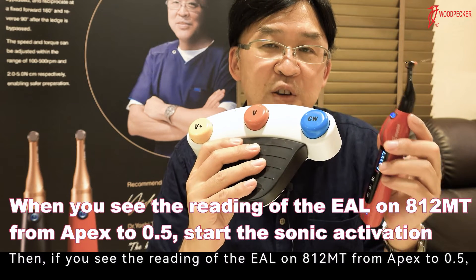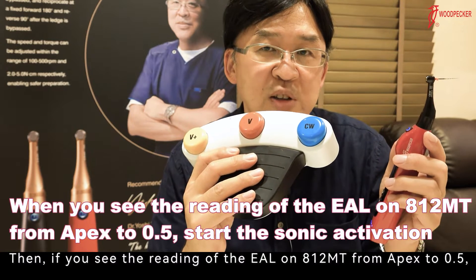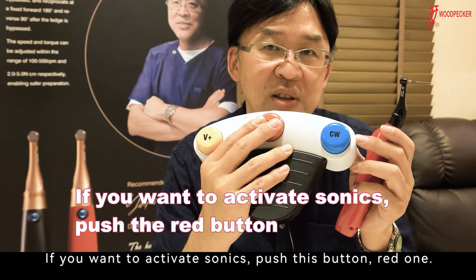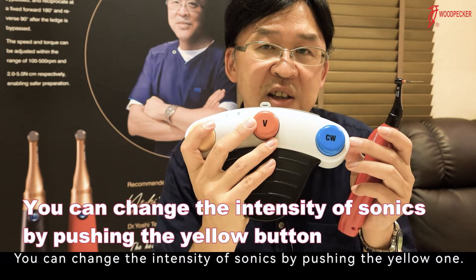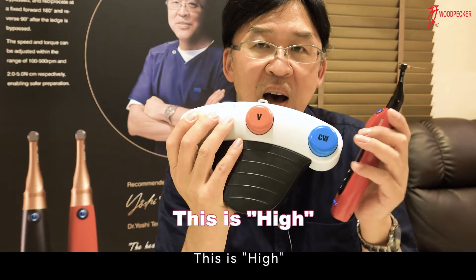If you see the reading of the apex locator on 812MT from apex to 0.5, then you can start sonic. To activate sonic, push the red button. You can change the intensity of sonic by pushing the yellow button — this is low, this is medium, this is high.